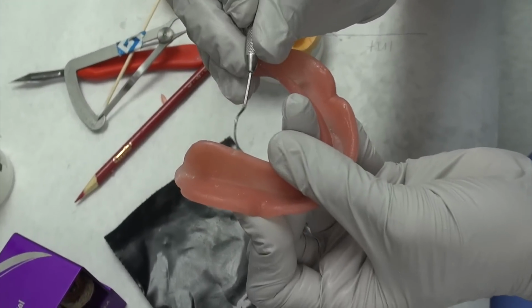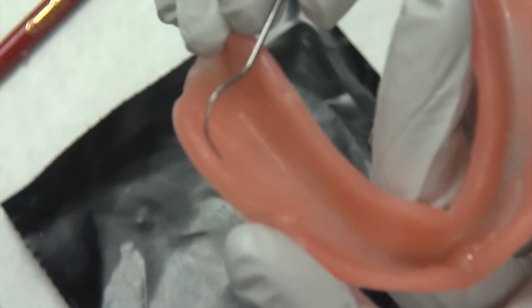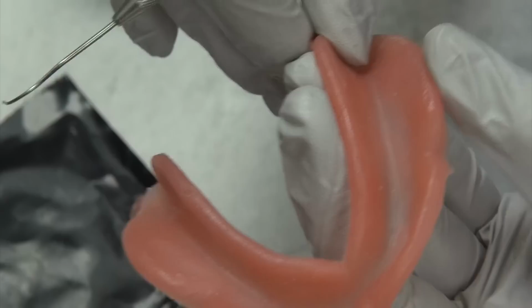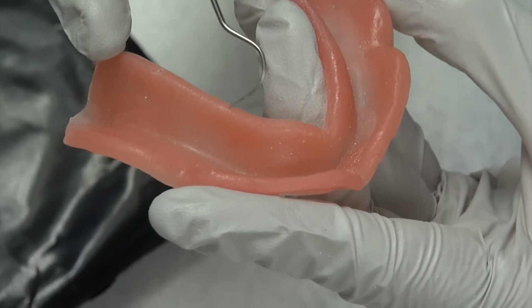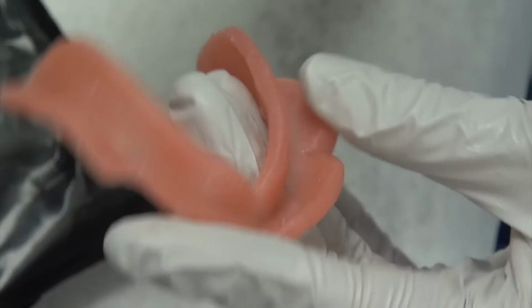So one of your deductions is going to be if the intaglio, the undersurface or the tissue surface, is not smooth. So is the tissue surface smooth? See these little divots here? This is probably the biggest divot. That comes from the air bubbles, okay? But do you see how all of this is very, very nice and smooth? So just depending on how it's graded, you may or may not get a deduction for that. So you want to be very, very aware of that.